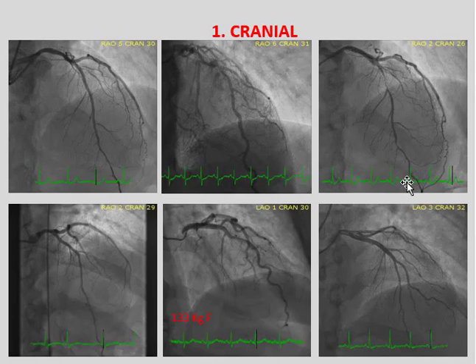Left main, LAD, and the circumflex. We'll just go through them all. Slightly different anatomy, slightly different contours, but this shows very nicely the LAD in every image. That's because cranial views are best for the LAD and the left main, whereas caudal views are better for the circumflex. All this should become clear to you as we move on.